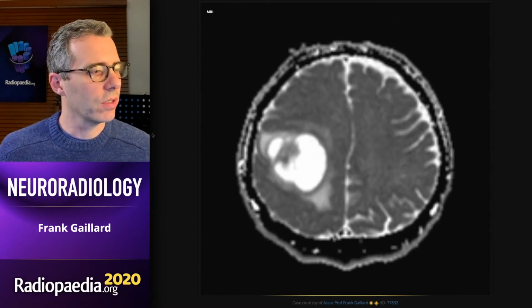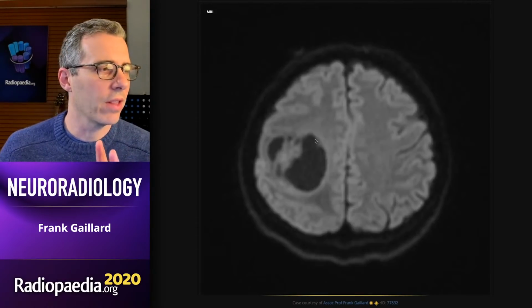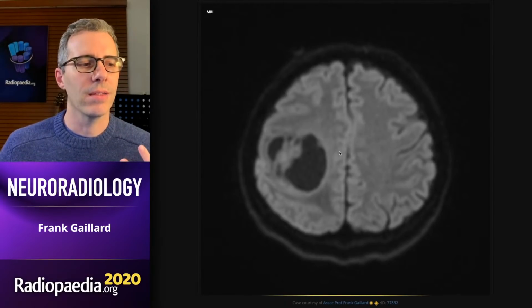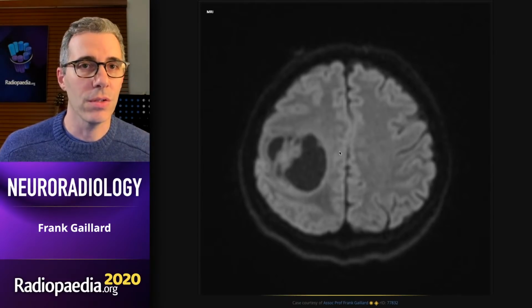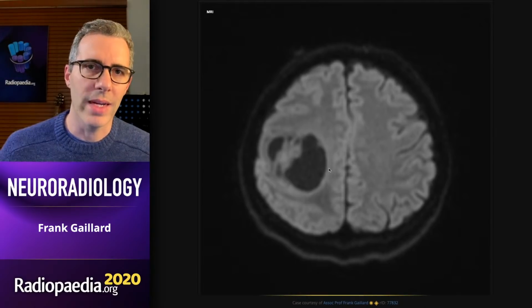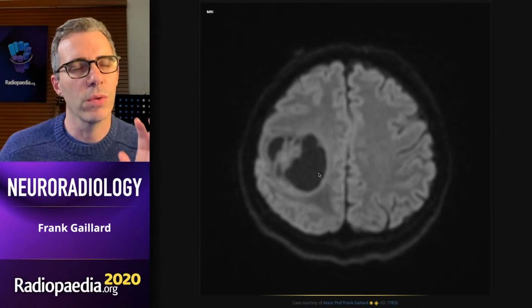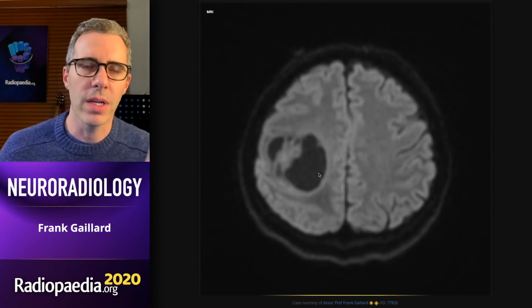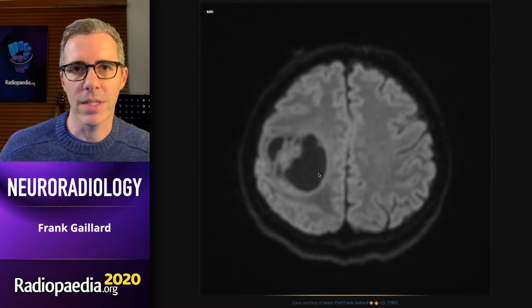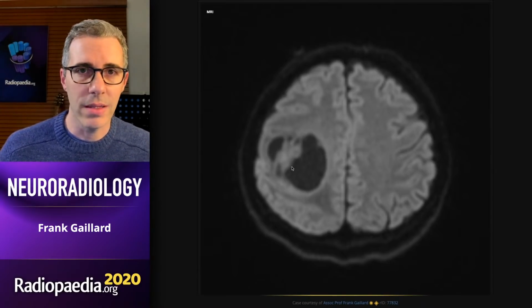And if we switch our attention to ADC, so one thing, I don't like DWI very much. For those of you that have heard me speak before, I tend to bang on about this. I'm going to continue to do this because I think this is really important. The only reason to look at the diffusion weighted imaging, or the B1000, is to tell you where to look, because what you're trying to assess is the diffusion characteristics of this lesion. There are some exceptions, but generally you're just after what the diffusion values are. In this case, you know where to look based on the other sequences. So you don't need the DWI.